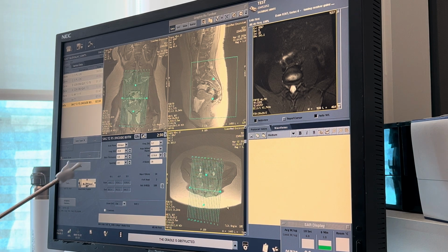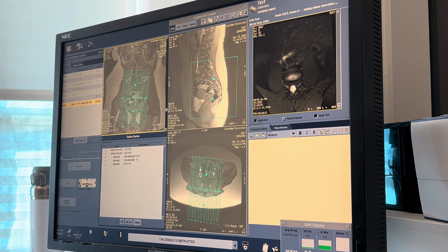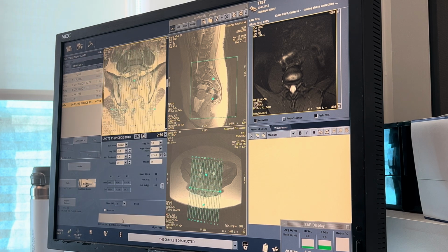We just want to check our coverage, and we can't really do that on a localizer, so we're going to select this plane, and we're going to select series and bring up the new coronal. Let's do the T1. Let's window that down just very slightly down and to the right. Perfect. Okay, so let's scroll through.